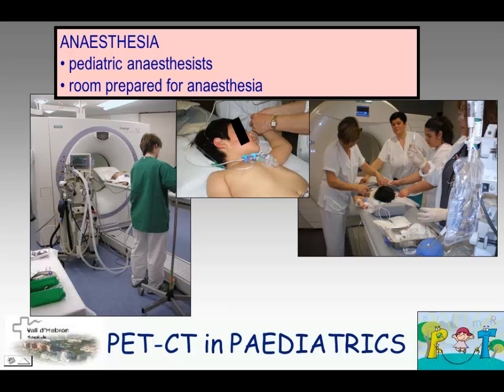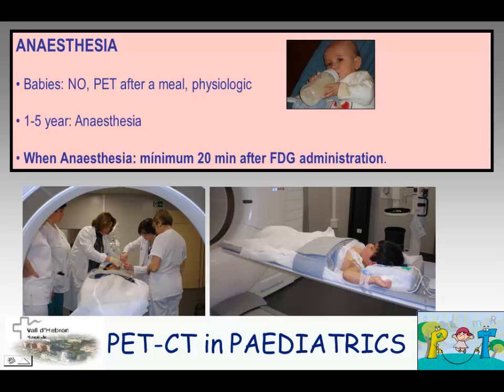And this is the setup that you have for an anesthesia on the PET-CT. The pediatric anesthetist is the one who is going to do the procedure, and our technologist prepares the room for the anesthesia. In babies, no anesthesia, PET after a meal, physiologic; 1 to 5 years, anesthesia.